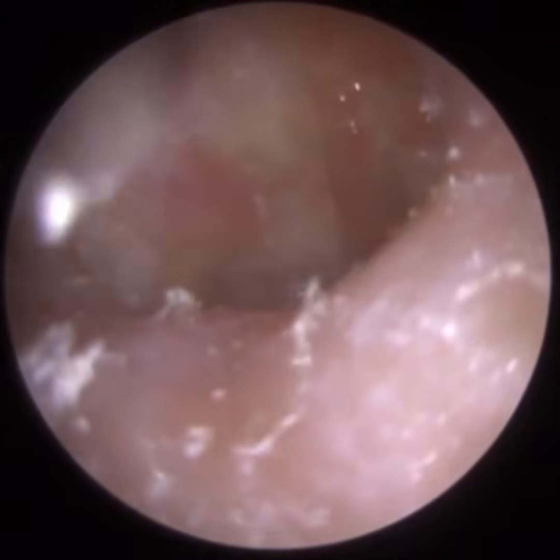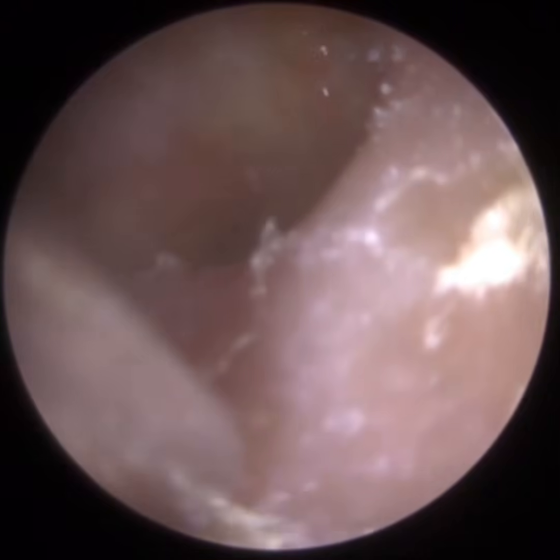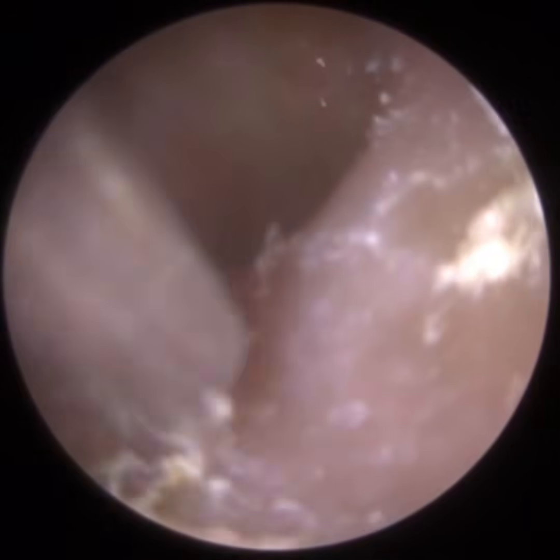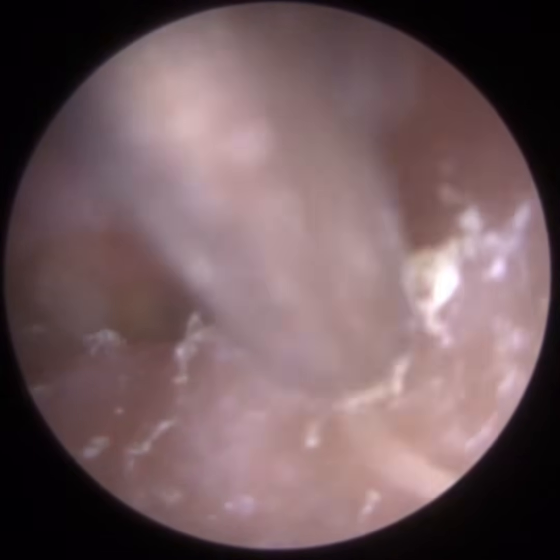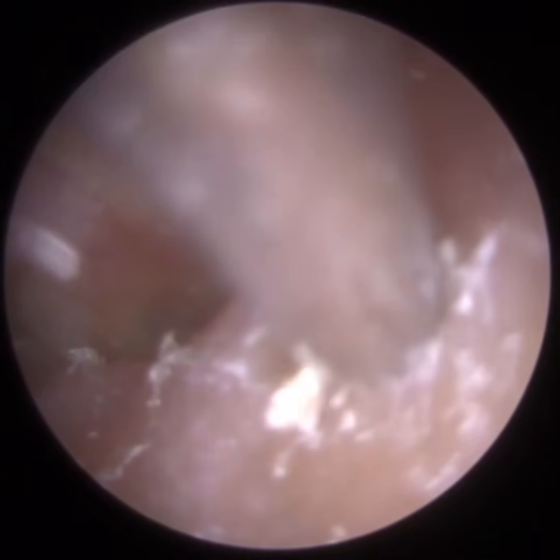So it's quite a lengthy procedure, but again, I think it was time well spent. The drier we can get this ear, the more dead skin we can remove. The longer it will take before the patient has to return to have the procedure performed again, and hopefully the simpler it will be next time as well. It won't be as complex, because today is pretty complex. There's a lot of peeling, removing stuff off the eardrum, multiple layers of dead infected skin.